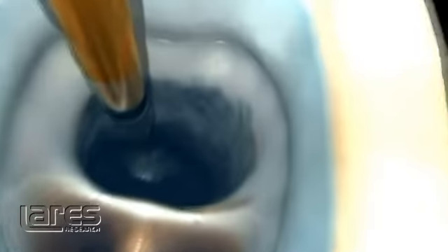Here we have a 3D rendering showing the PIPS protocol. This unique tip design is lowered into the coronal portion of the tooth being endodontically treated until the tapered and stripped portion only is submerged into the fluid-filled access opening. Note that it is not necessary to place the tip down into the actual canal.